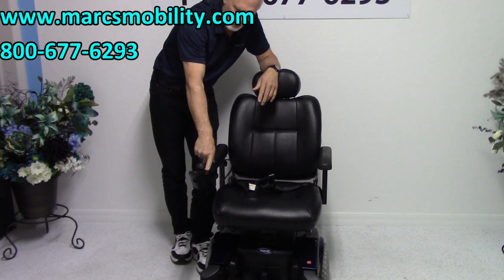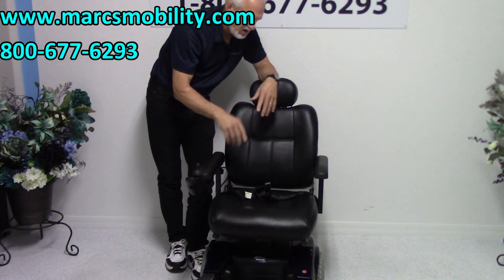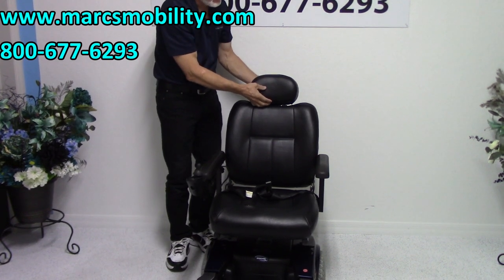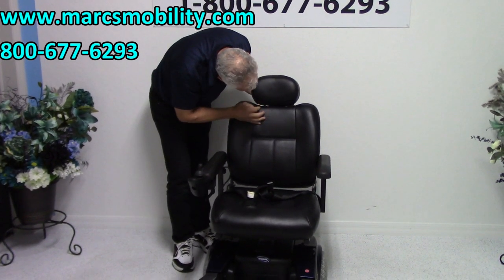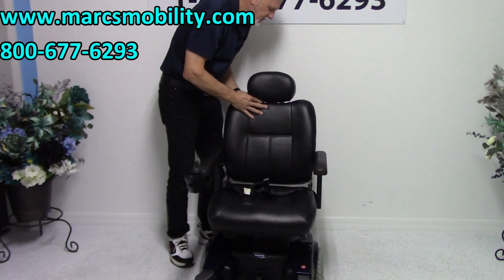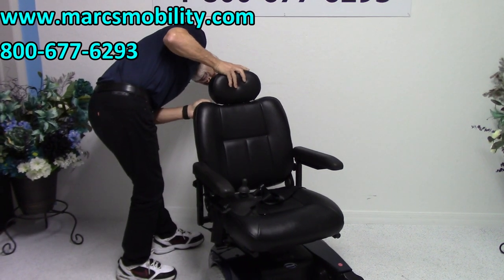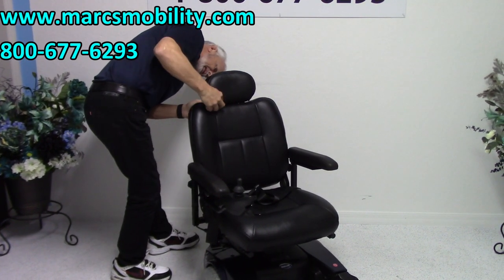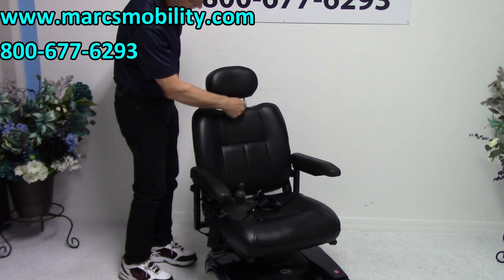The joystick is on the right. If you're left-handed, we can switch it to the left — no problem at all. You have an adjustable headrest. I can find the lever — there you go, it's right here in the front.